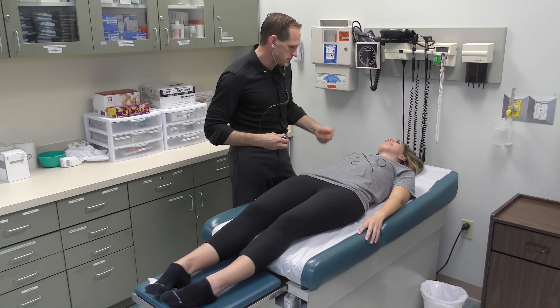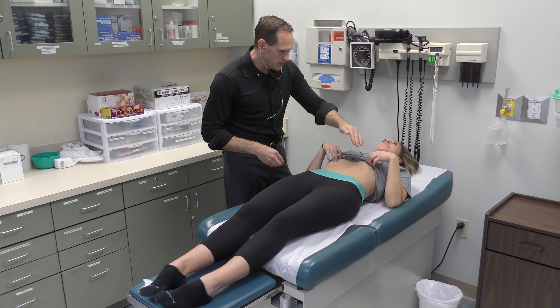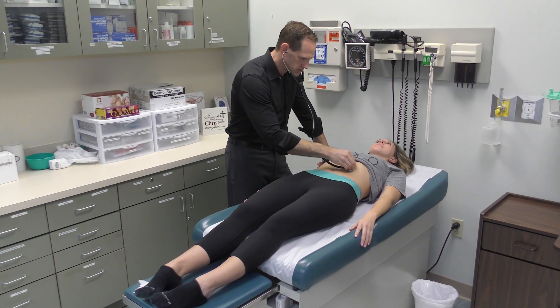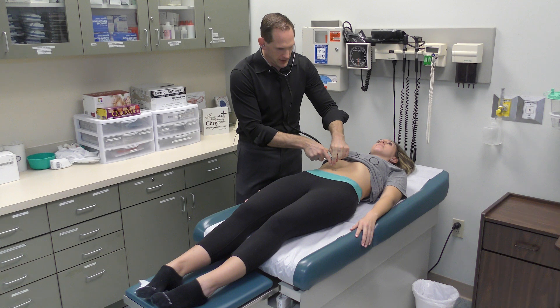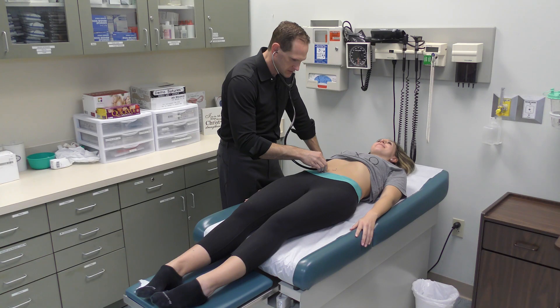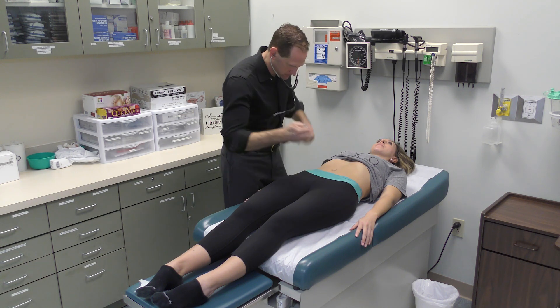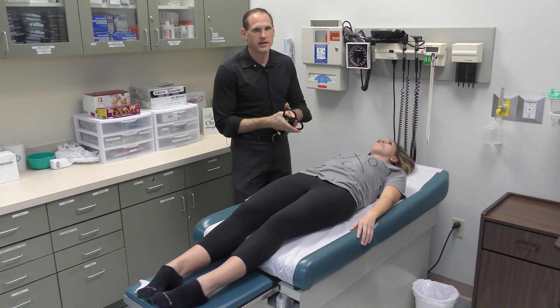Next we're going to listen to the abdominal pulses. Here we have the patient's costal margin and the umbilicus. Just below the costal margin we have the aorta. Then just a little bit lower to the sides we have the renal arteries. From the umbilicus going at a 45-degree angle outwards we have the iliac arteries. And just inside the iliac crest we have the femoral arteries. We've now auscultated the abdominal arteries and are ready to palpate.